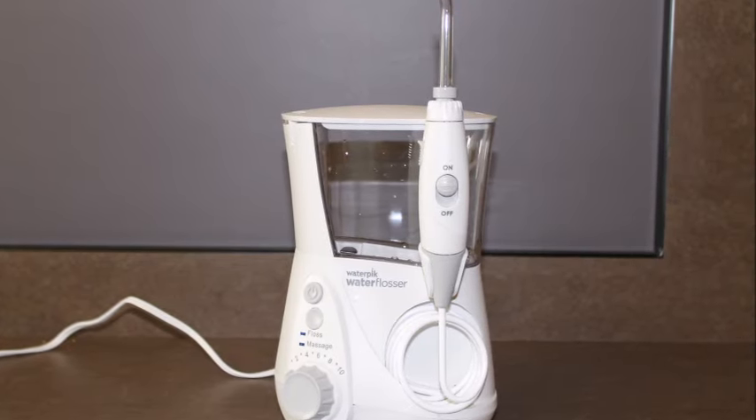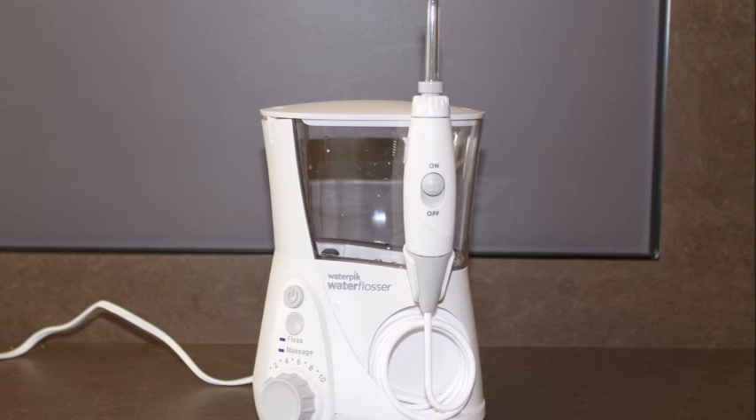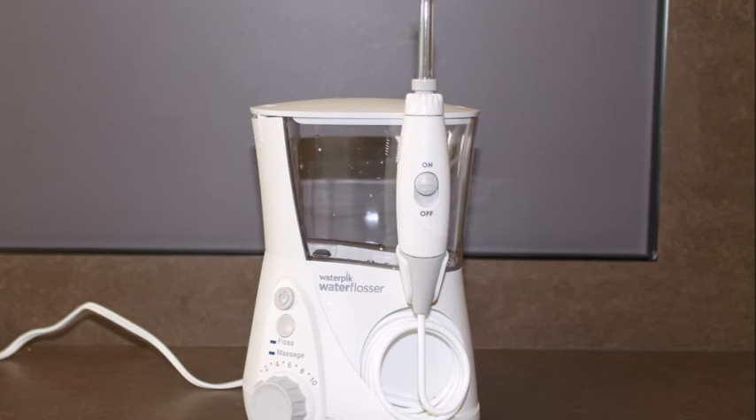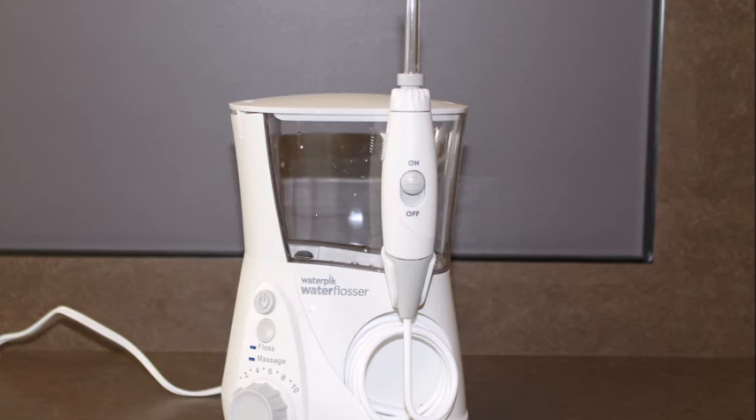So if you're brushing and flossing this effectively, why do you need a water pick? Many people like you already have deeper pockets or contours around crowns, bridges, or implants that make it impossible to reach all of the plaque with just brushing or flossing. If the pocket depths are greater than two or three millimeters, the floss or brush can't reach the depth of the pocket and the plaque will continue to thrive there. The pulsating jet of water from a home irrigator can reach these areas more effectively than anything else. Home irrigation is a skill that takes a little time to master, but it's well worth the effort.